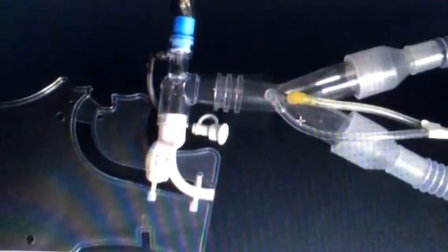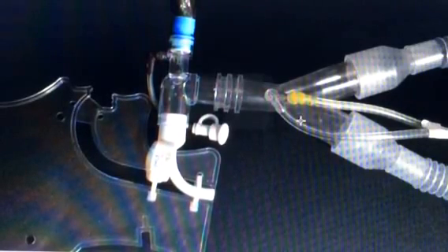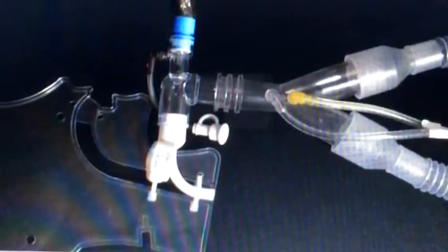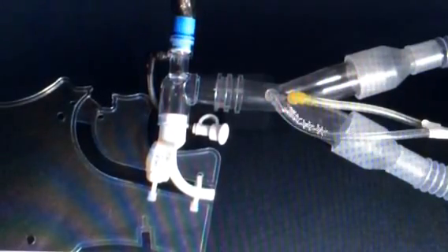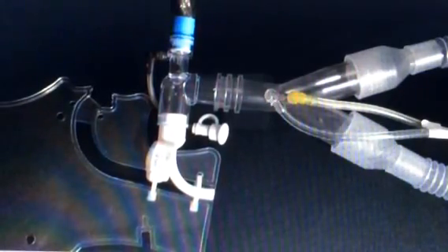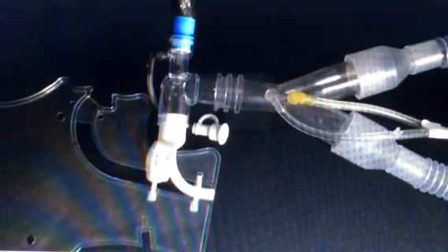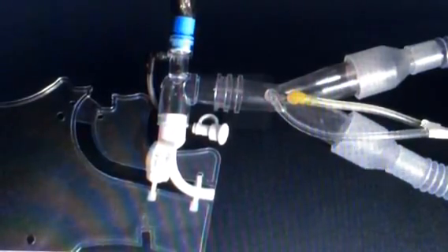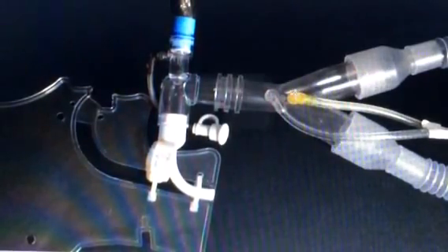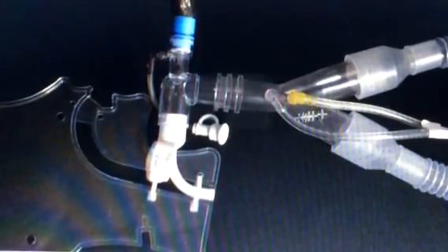Simply press the manual breath button on the ventilator. The manual breath button gives an extra breath to the patient, but at the same time it sends a bolus of air through these tubes to clean them out. So give a manual breath, another manual breath, and it will clear out these tubes.